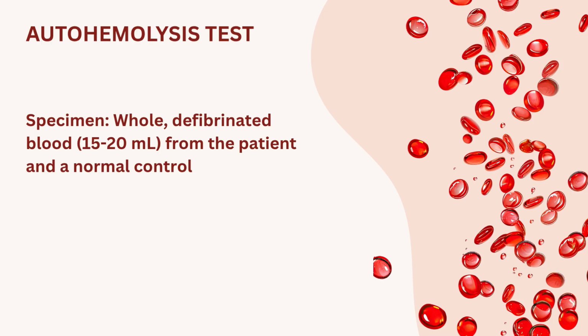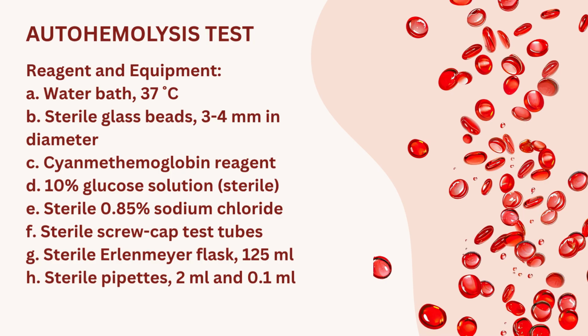So the specimen to be used is whole blood, whole defibrinated blood. So about 15 to 20 ml from the patient and a normal control. So please take note, this procedure should be performed in a sterile environment, or you should maintain the sterility of the equipment and the reagents that will be used.